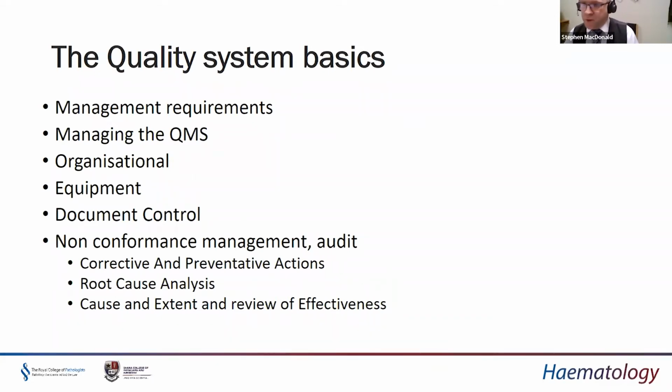We know that it's valid because we periodically review it, and we review it in the context of what the laboratory's needs are and what the clinician's needs are. And that'll be a big chunk of what I talk about in the coming presentation.